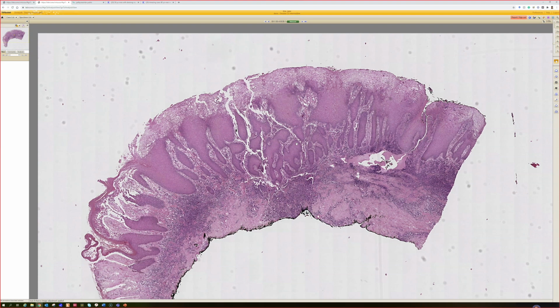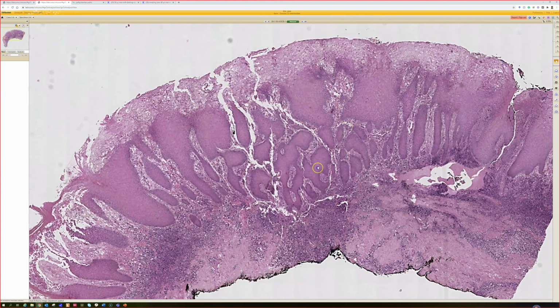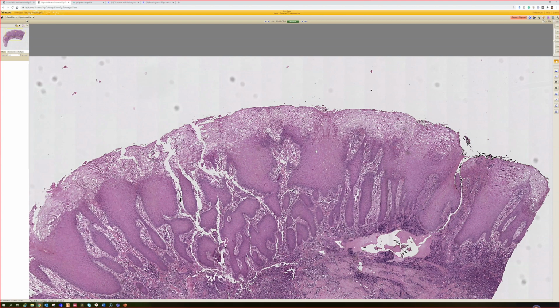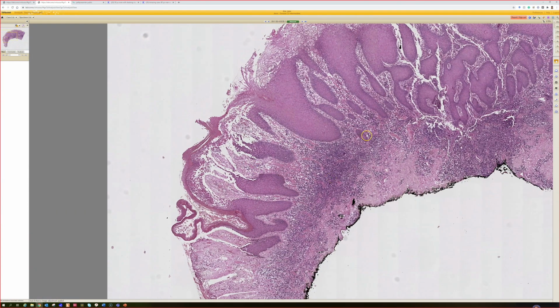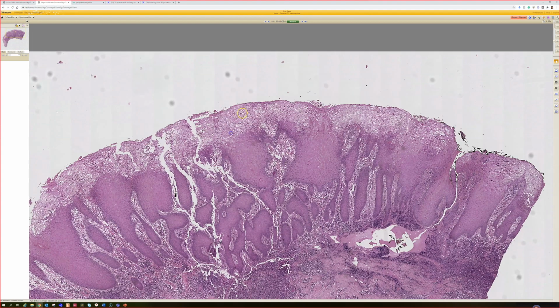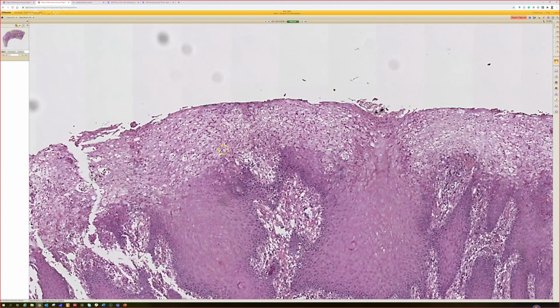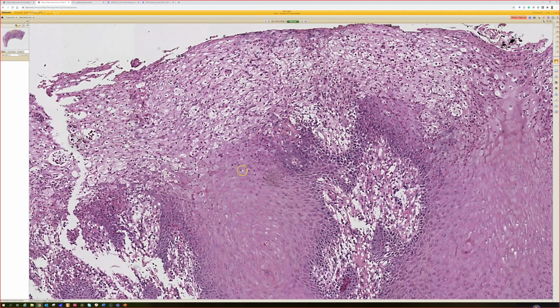So initially it looks like we have a shaved biopsy, maybe of a mucosal site. There's a lot of clear cell change up top, and then part of it's eroded and ulcerated to the edge too. My first thought was, is this like PEH with pus, like pseudoepitheliomatous hyperplasia? It seems kind of up more superficially, but really neutrophils aren't found more in the deeper areas. It's just kind of lymphoplasmacytic inflammation.